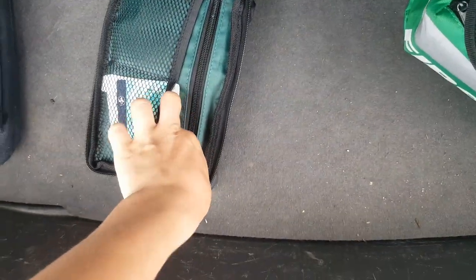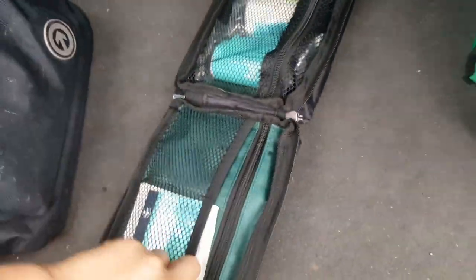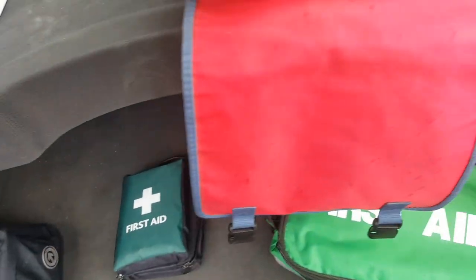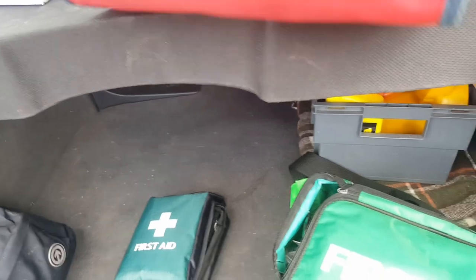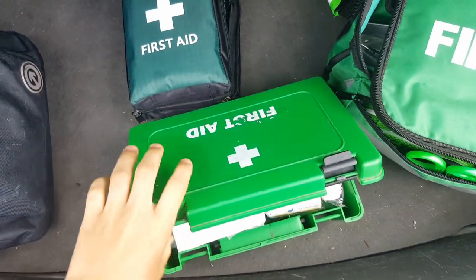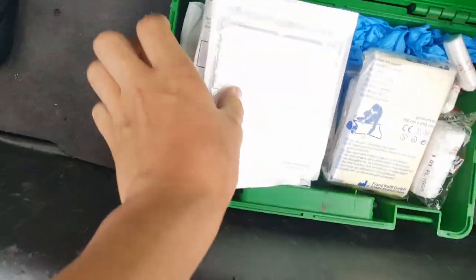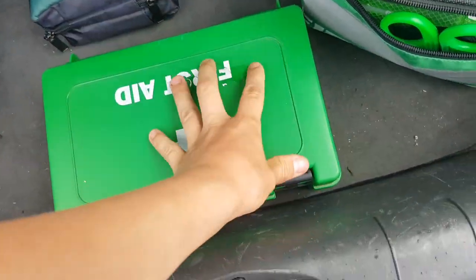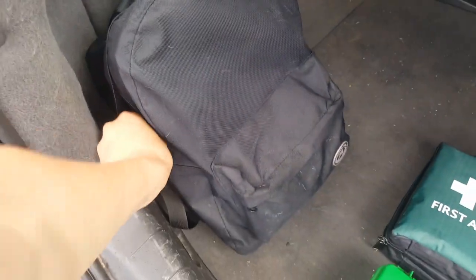We've got some gloves and foil blankets, some bandages in there. I'm not going to go into too much detail because these are all bigger kits. Then you can see we've got the bigger kit in here which unfortunately is missing one of the clips. In this first aid kit slash box we have different dressings — all sorts in there.